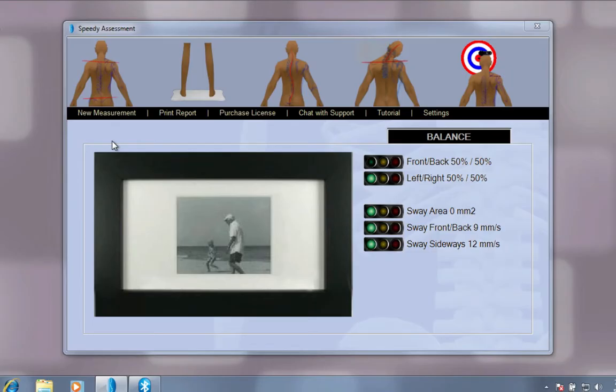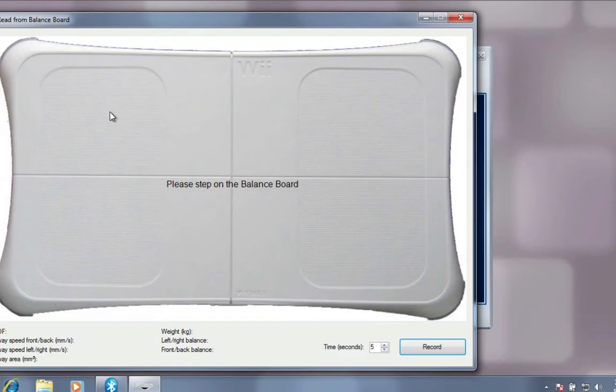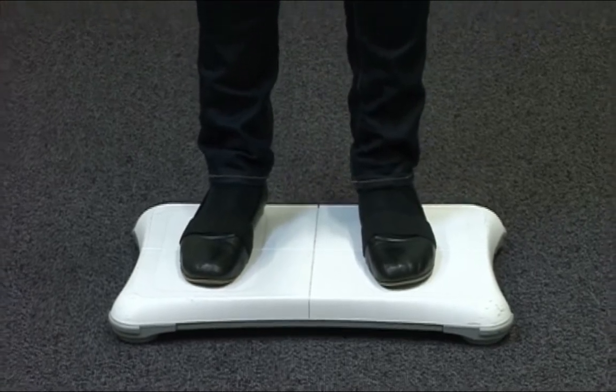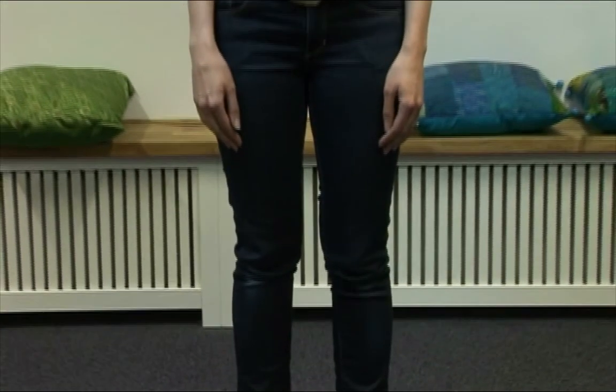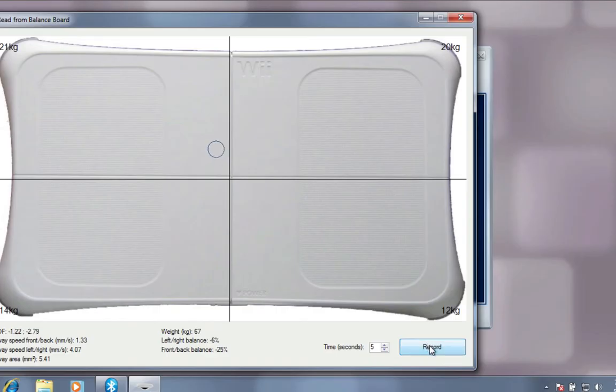Now you are ready to perform the test. Click on New Measurement. A window opens. Please step on the balance board. The patient is stepping up on the balance board. Here you see the patient's centre of gravity. When the patient is standing completely still, press Record.